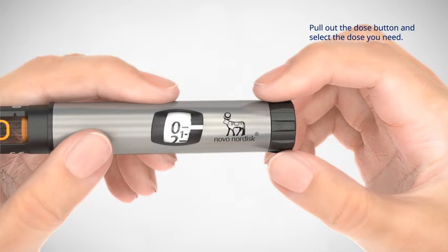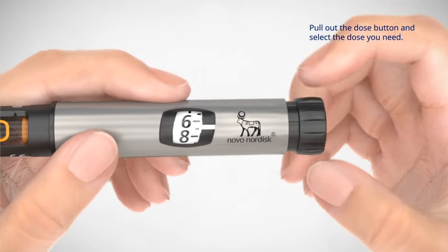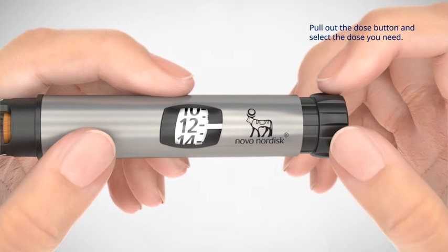To select a dose, pull out the dose button and turn it to select the number of units you need to inject. Adjust the dose by dialing forward or backward if necessary.